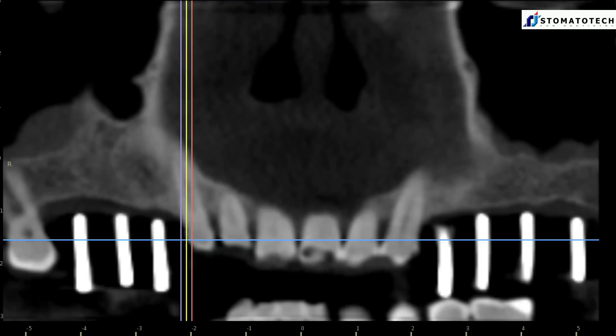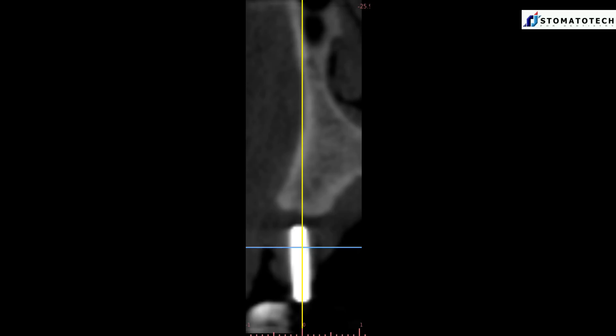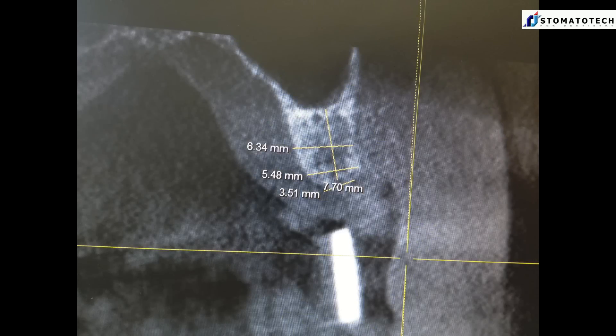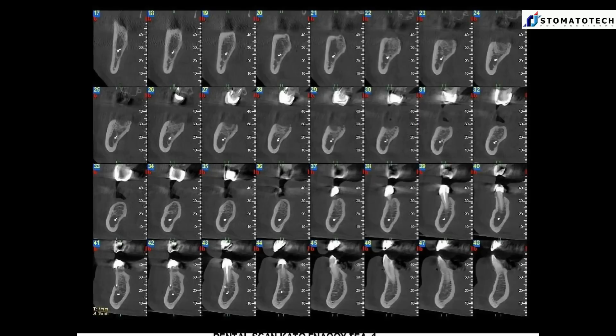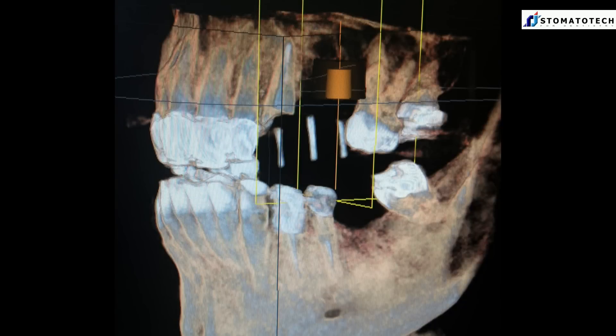The presence of the markers in the 3D x-ray images provides location, orientation, and alignment — making one slice relevant for the osteotomy and leaving the rest of the images aside. Using any available planning software in combination with the SG Marker Kit turns the 3D x-ray into a win-win tool for the general practitioner as well as for the specialist.